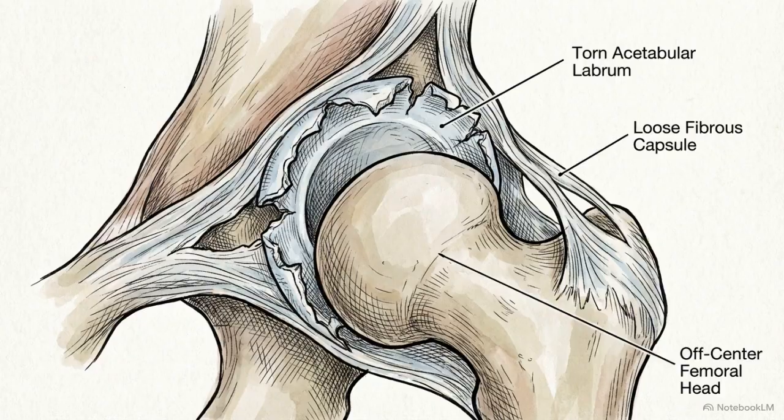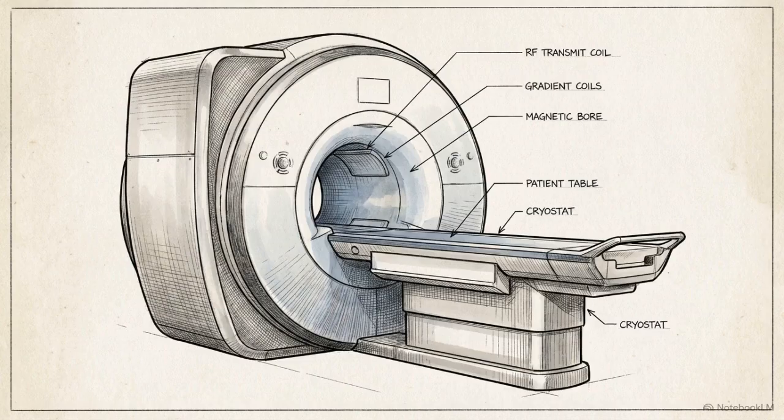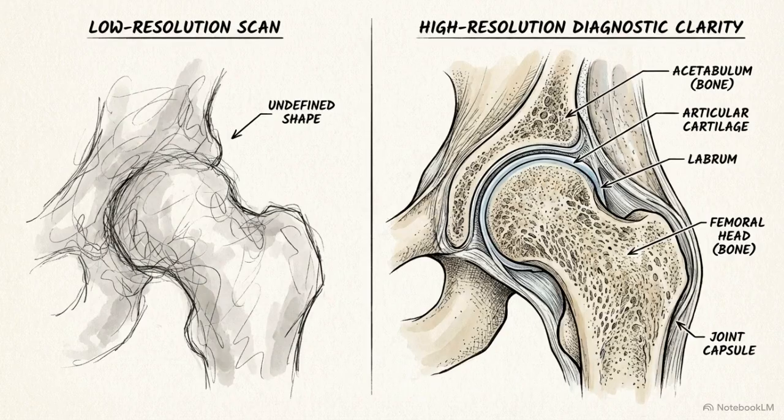Pathologic failure in any single component of this triad compromises the joint's mechanics, creating a cascade effect of instability. Accurately diagnosing these failures requires rigorous MRI mapping. MRI is the primary imaging tool for direct evaluation of these structures. Its high in-plane resolution is required to depict the anatomy and pathology of these small, variable tissues.